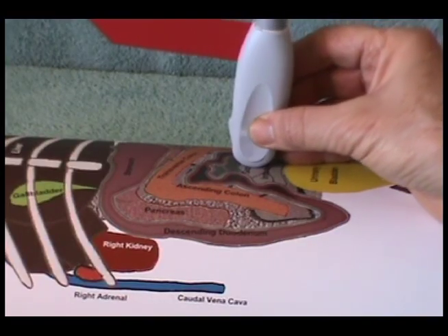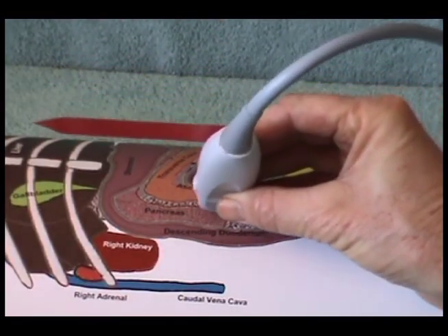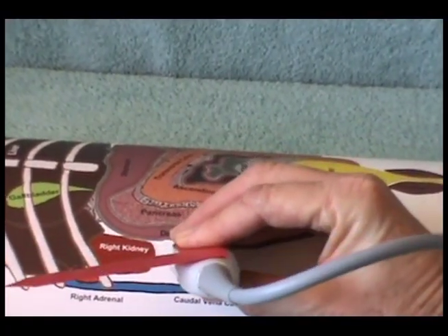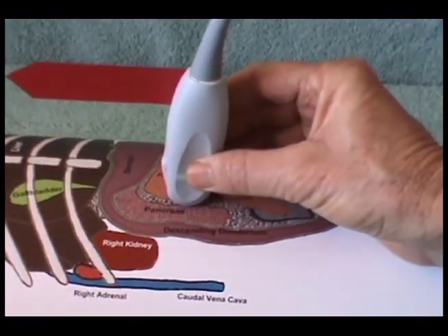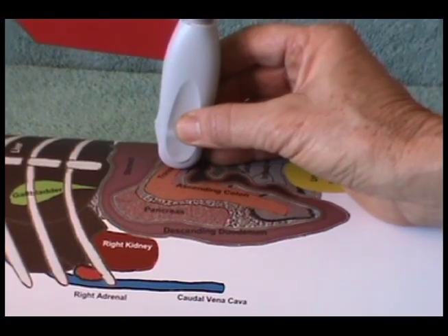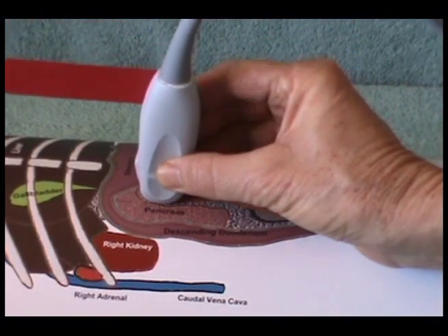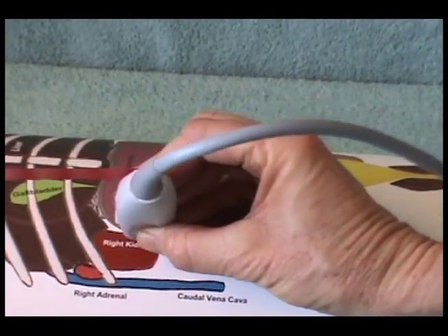The purpose of the zigzag pattern is to examine the right caudal quadrant of the abdomen for effusions or any lesions of the intestines, mesenteric lymph nodes, or right limb of the pancreas. The transducer will be passing over the ascending colon and descending duodenum. The right limb of the pancreas is located between these structures.